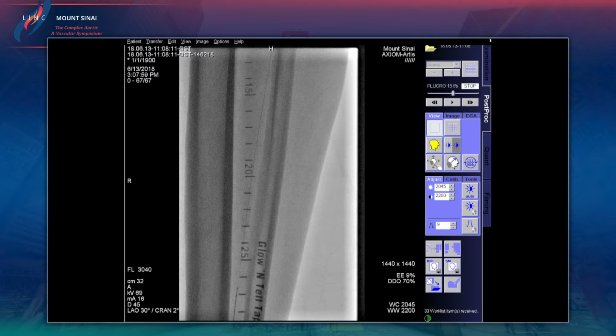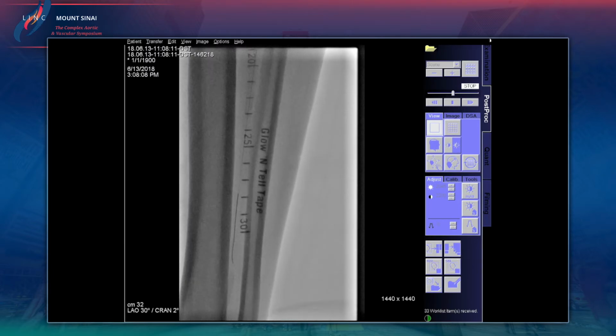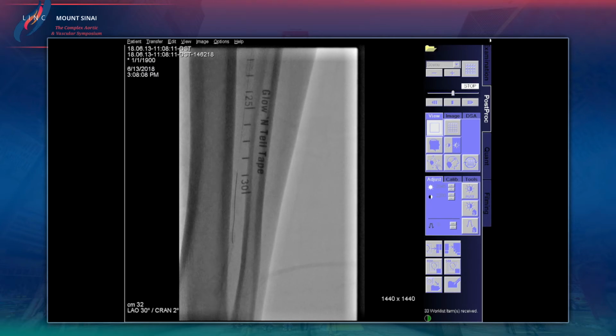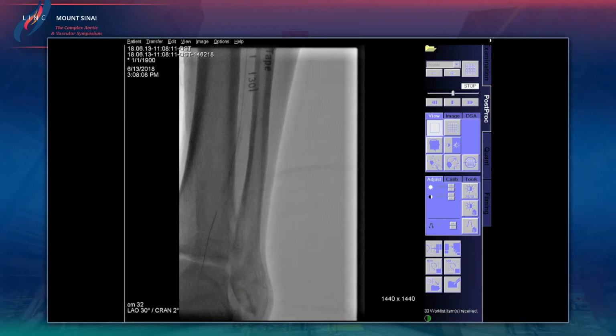The issue Flora, please, the wire's coming back. It's my mistake. Is that when you're dealing with a thrombosed graft, or I should say not graft, a thrombosed DCB site, which we do get. Do you go ahead and put them on Coumadin, or do you put them on NOACs?